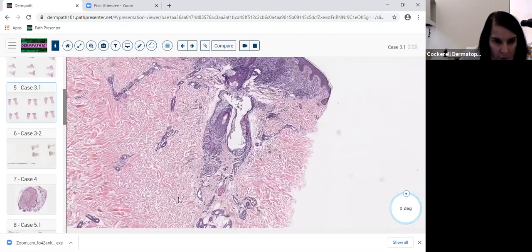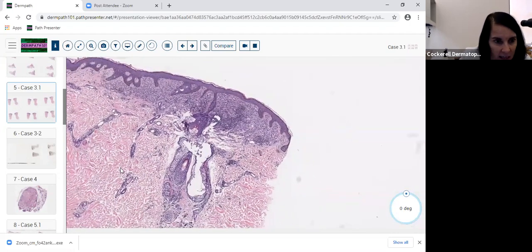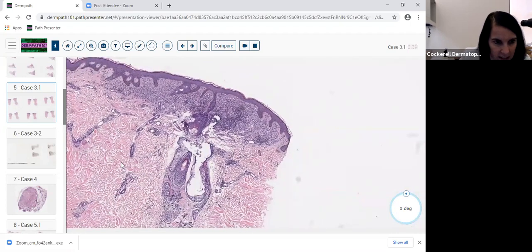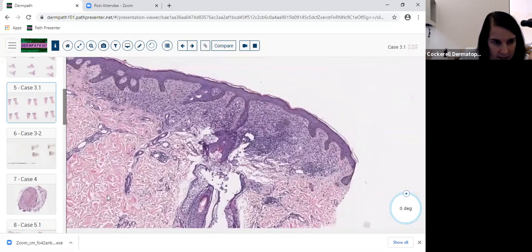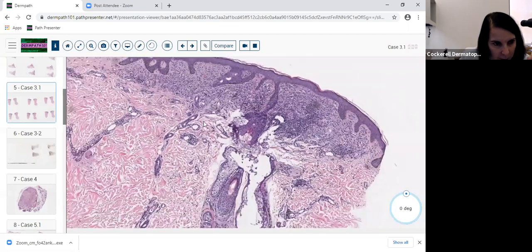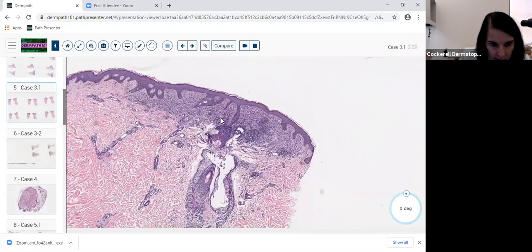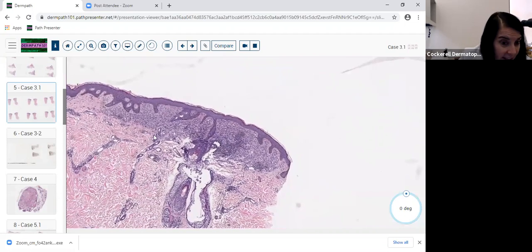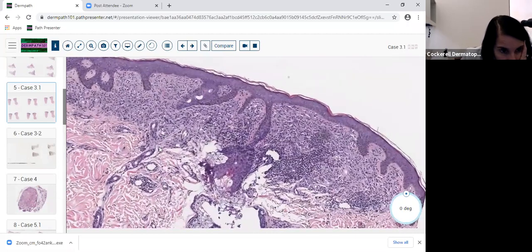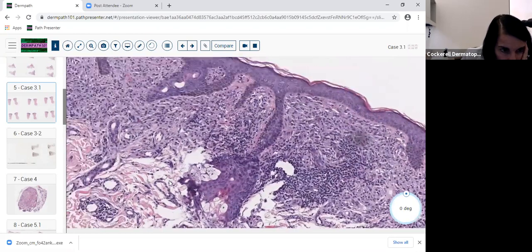Because the first biopsy on this just had a superficial perivascular dermatitis with some scattered cells. But the second biopsy, this is the part B of the case, actually had this sheet of cells. And it's somewhat of a macule and a papule combined, clinically and histologically. You could imagine what this looked like clinically. And right away, you see this grouping of cells, and you're saying to yourself, well, could this be a nevus?